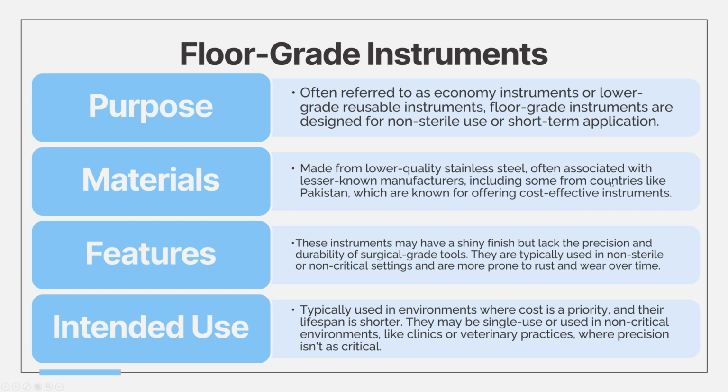And again, I want to reiterate why we have to separate surgical grade or OR grade instruments from floor grade instruments.